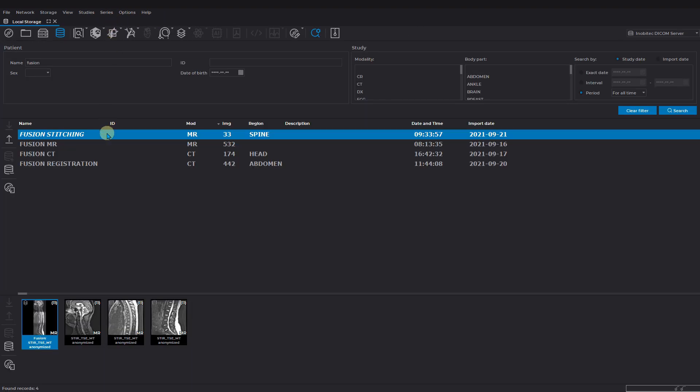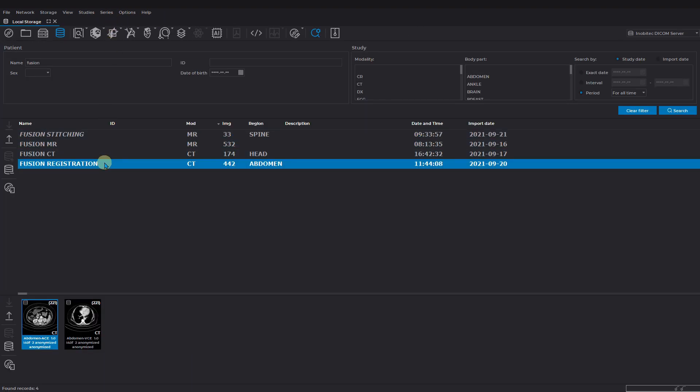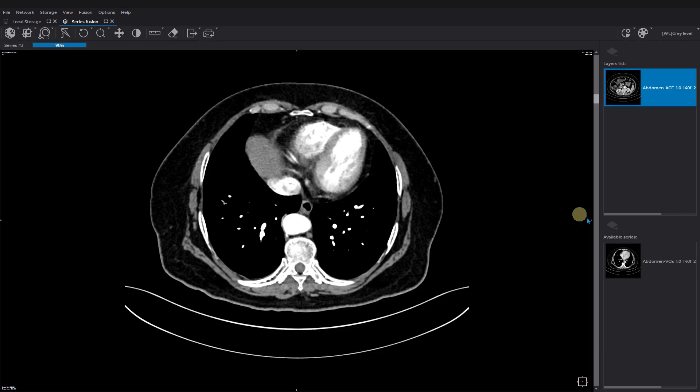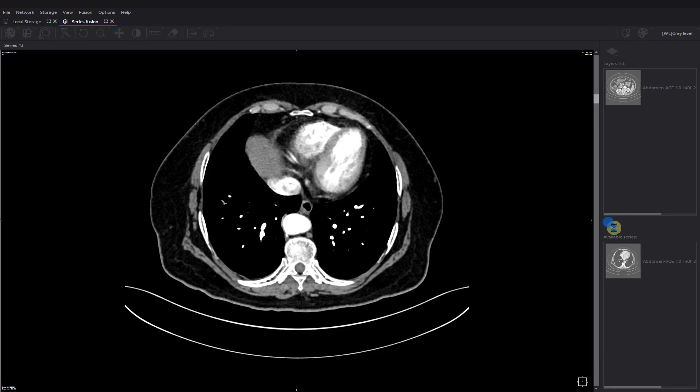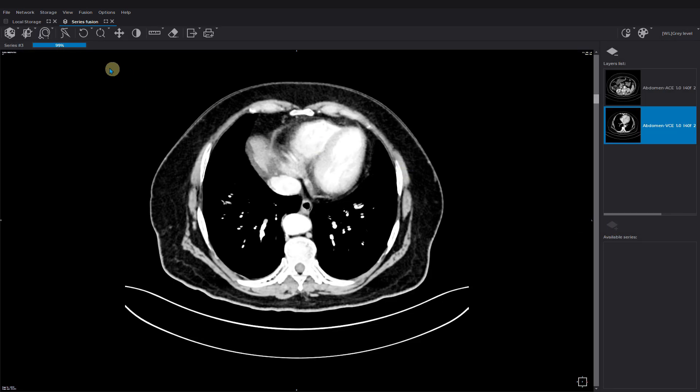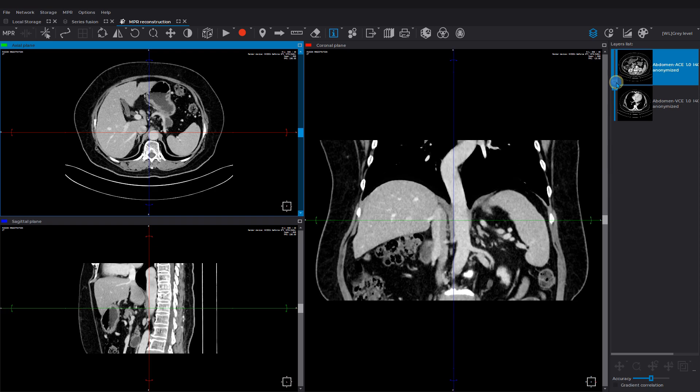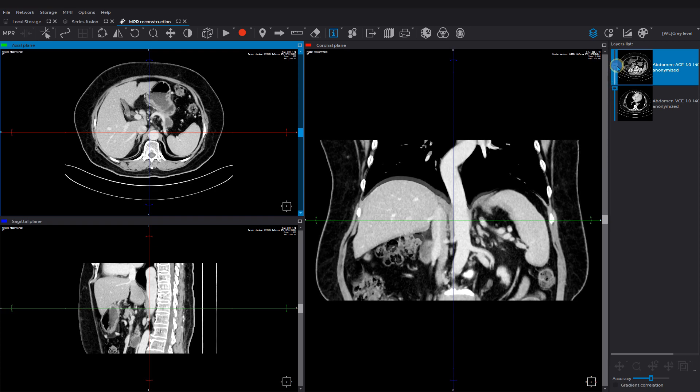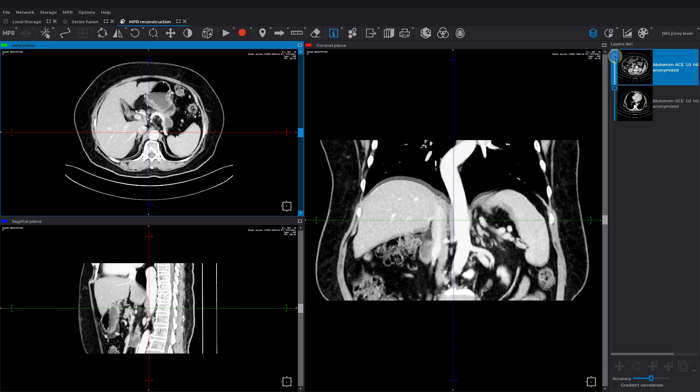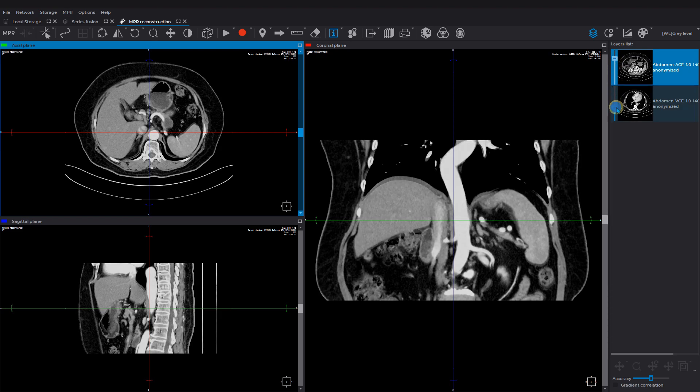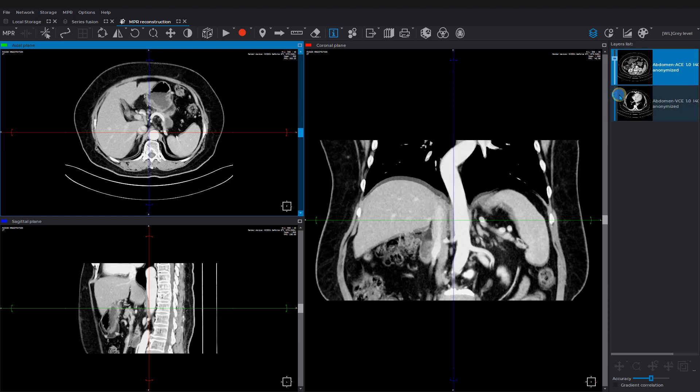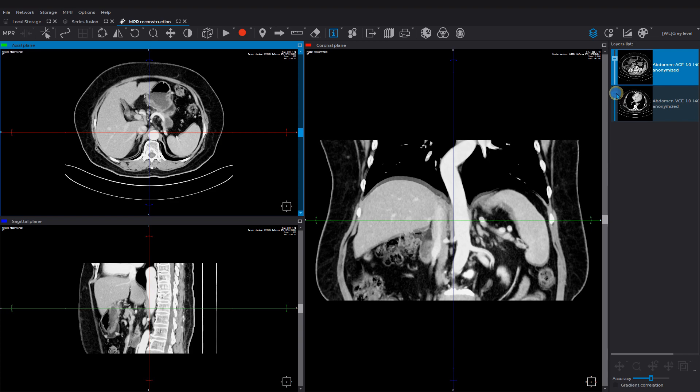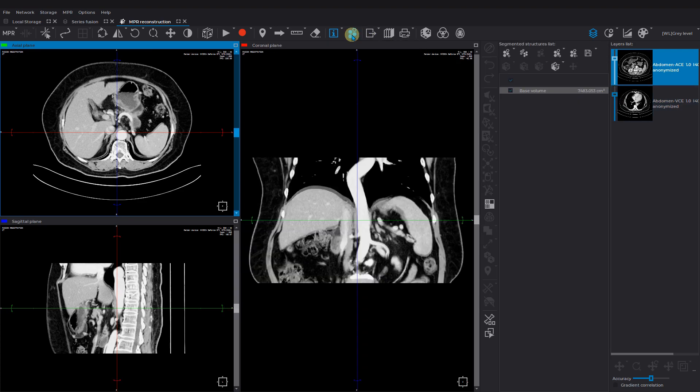For a non-rigid registration you need to merge series of the same modality and open the result on multi-planar or 3D reconstruction view. Let's compare the layers using the transparency sliders. It's easy to see on the coronal plane that the layers do not match. Open the segmented structure panel and select the volume registration tool, previously choosing the layer for the fixed volume.